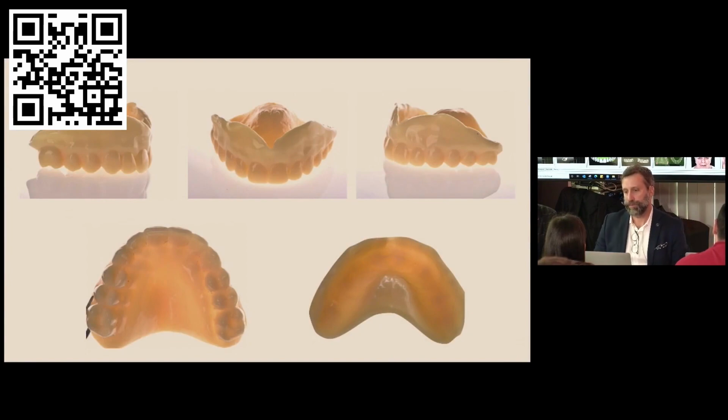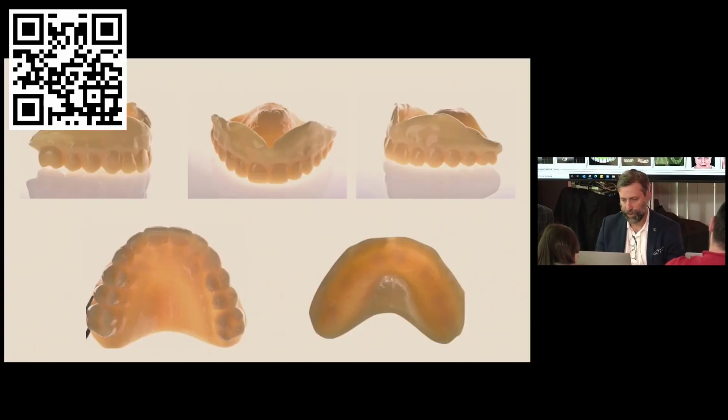Oh yeah, that's important. The mock-up. What can we do for denture patients for the mock-up, right? There are two possibilities. If the design is mostly additive, and many times it is, because the dentures usually are, we can just use the denture and transfer the mock-up as we do over teeth. So Bisacryl, transfer, and place the old denture in the mouth and take a look at how it looks. Or we can print a provisional denture, or we call it a mock-up denture, which is what we did here.